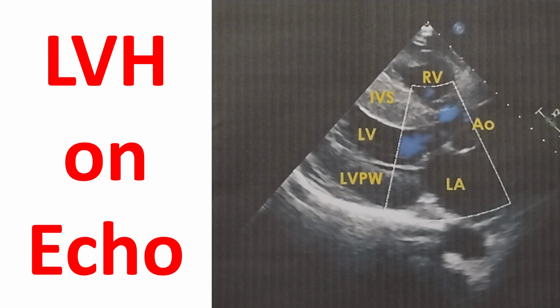Echo is detection of the reflected ultrasound beam. This is the left atrium, a bit dilated, and the aorta. So this is concentric left ventricular hypertrophy seen from the parasternal long axis view.